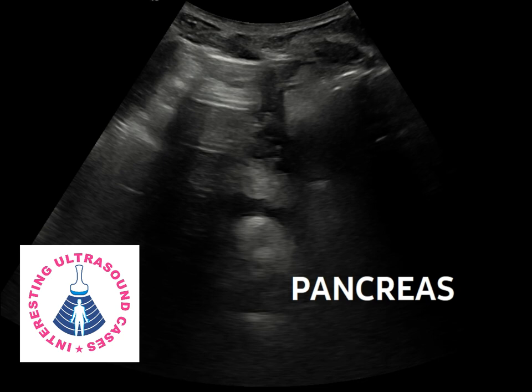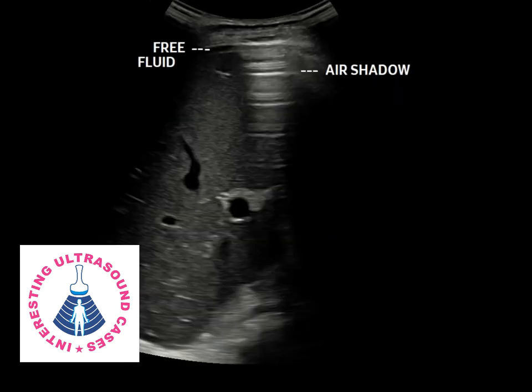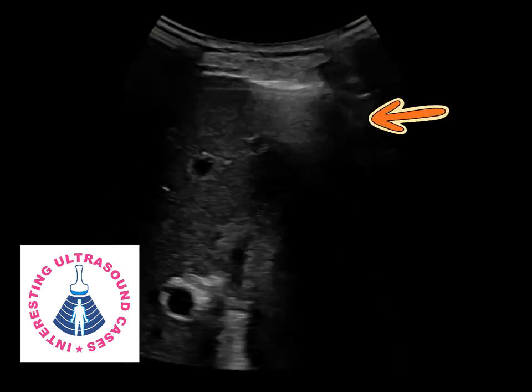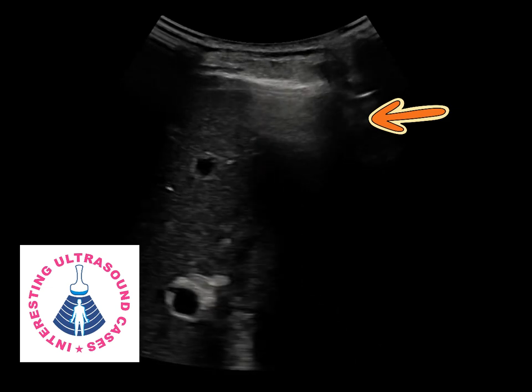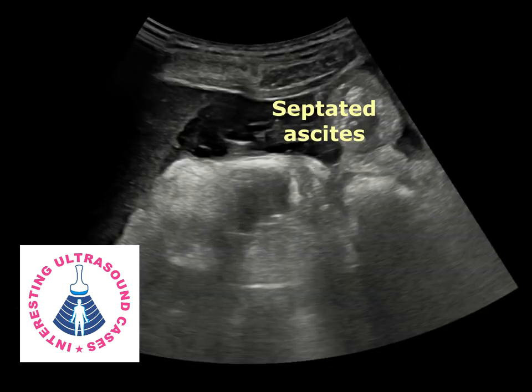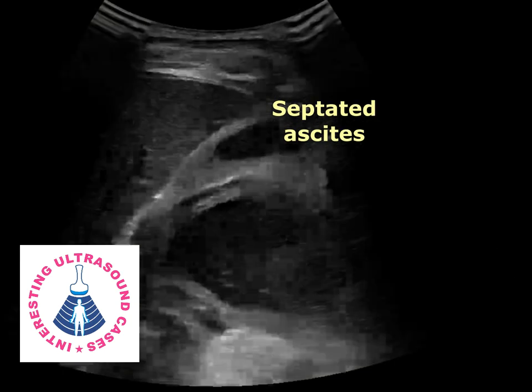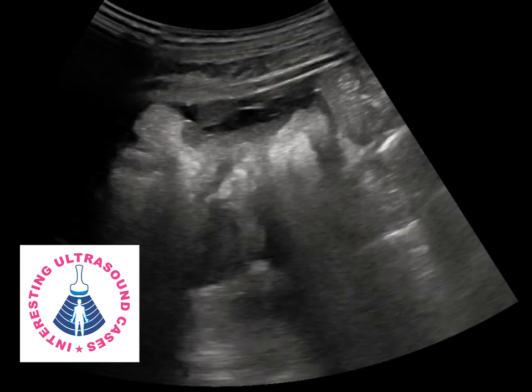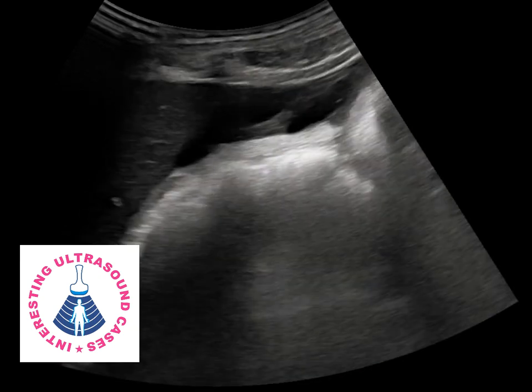On ultrasound examination, the pancreas was normal. There was air anterior to the liver capsule casting a shadow over the liver surface, which is suggestive of pneumoperitoneum. There was also septated ascites and diffuse omental thickening. The presence of pneumoperitoneum and ascites suggests perforated peritonitis.